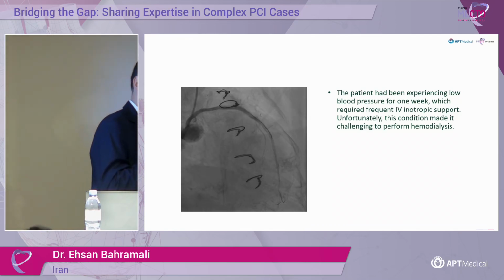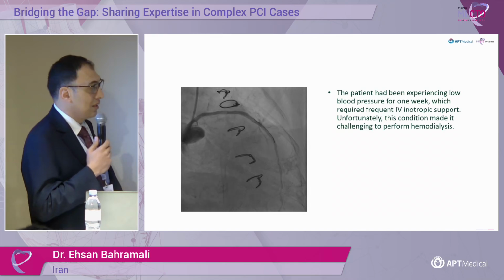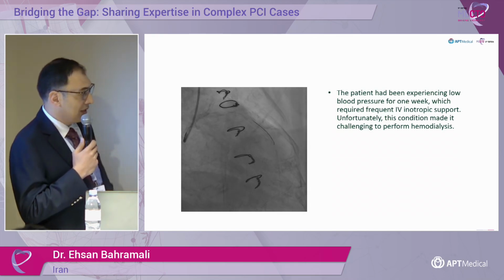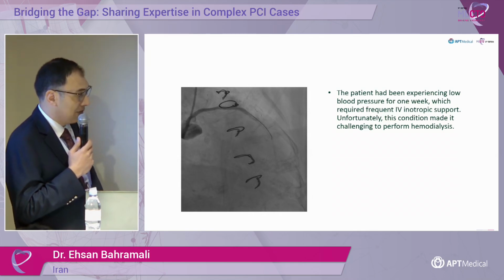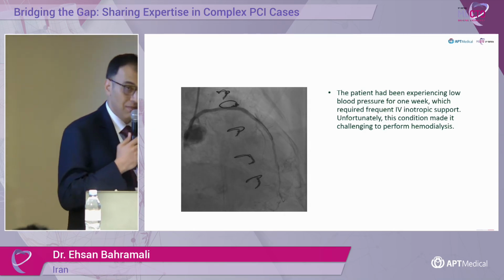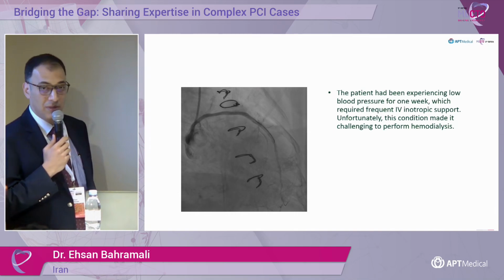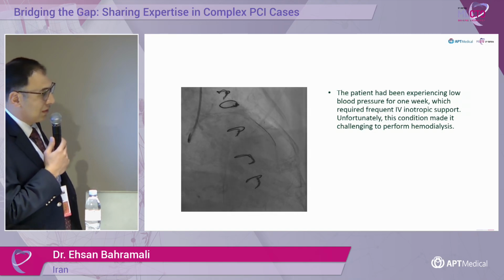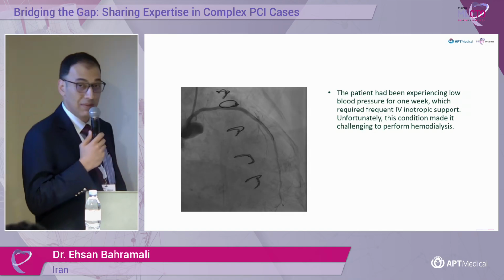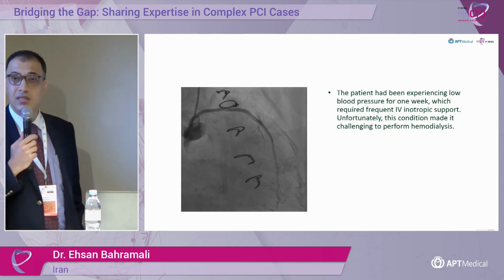Your question was about the drug-eluting balloons or the stenting? Yes, or stenting at the anastomotic part. Yeah. For the distal vessel, I guess the DEB was a good option for us. And in the final image, we have minimal dissection, which is a good thing to deliver the drug on the balloon. I think because the TIMI flow is free, it's a good thing to have a very micro dissection at the end of the vessel. Good.